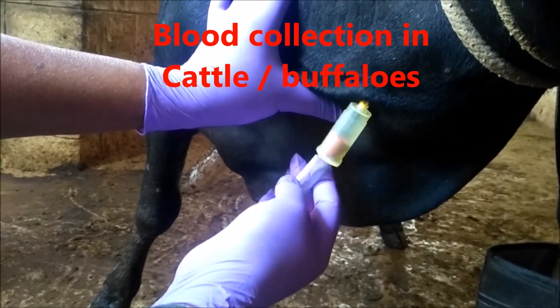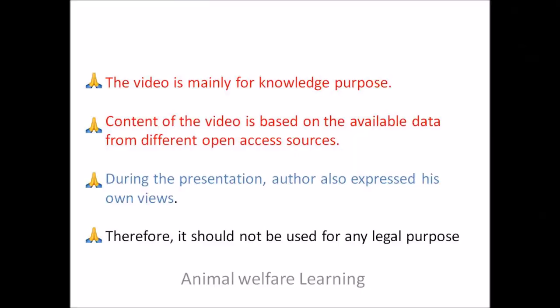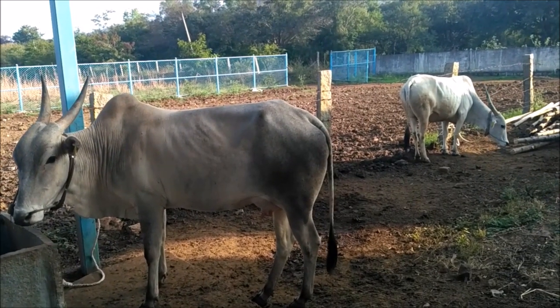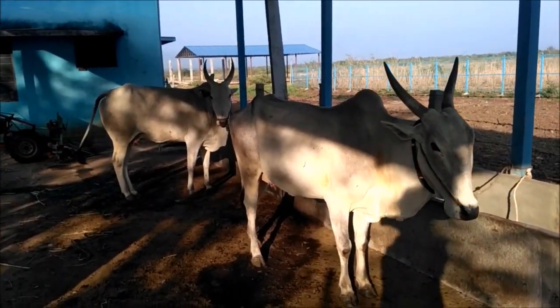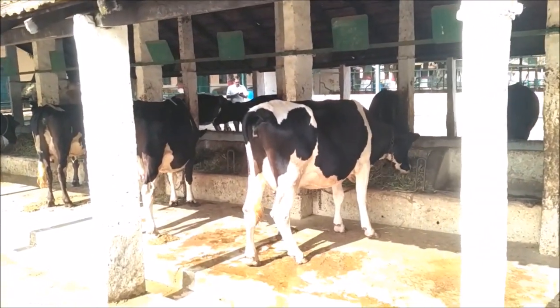In this video, we will be discussing how to collect blood from cattle and buffaloes. Blood is generally collected for various purposes, like blood tests for any abnormalities so that it can be treated properly, and for various research activities for teaching and learning.